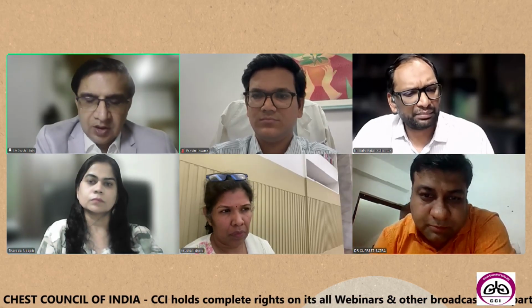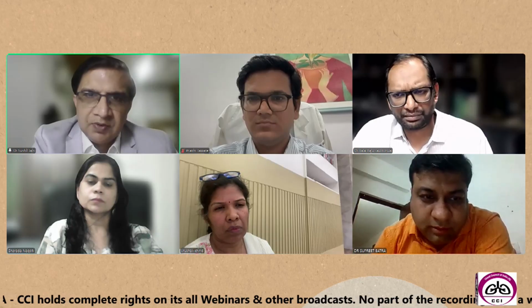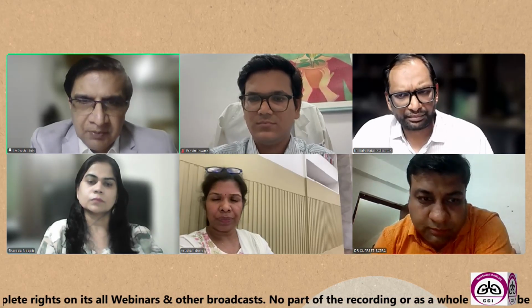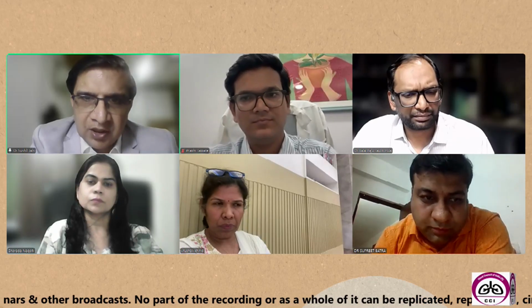Thank you. I think that's important, that even if it's a necrotic lymph node, you still do 3 to 4 passes, and send the tissue properly for cultures and histopathology both. And if you are able to see any part of the lymph node which is non-necrotic, we may try to take a sample from that part of the lymph node. I think that may add on. Do you agree, Dr. Supreet?